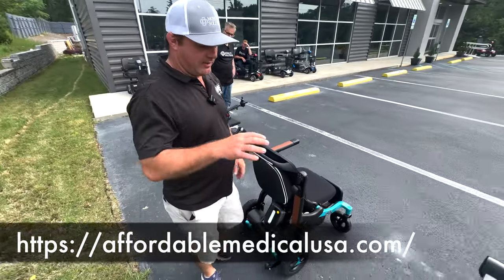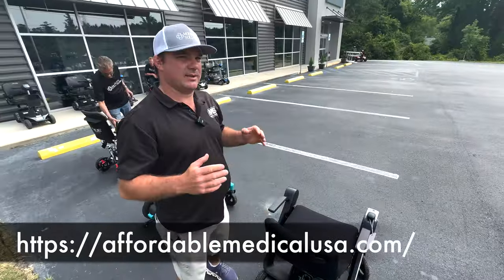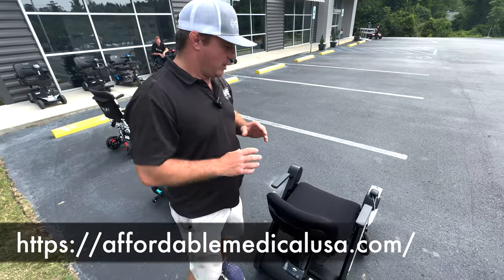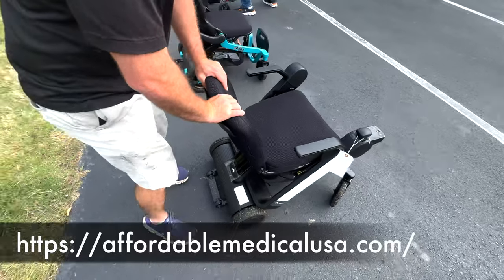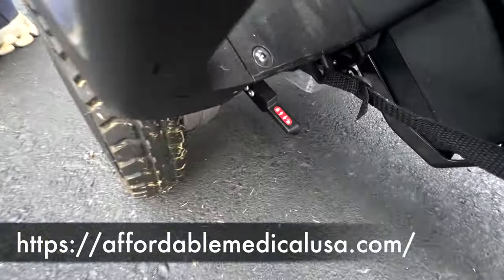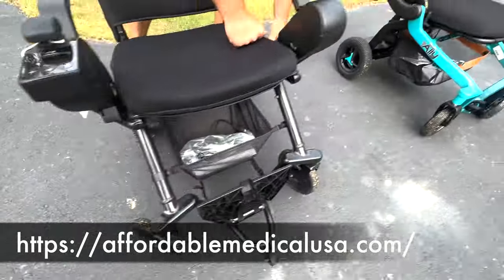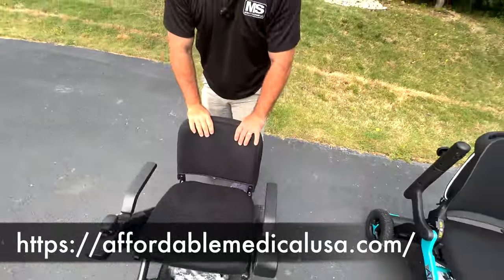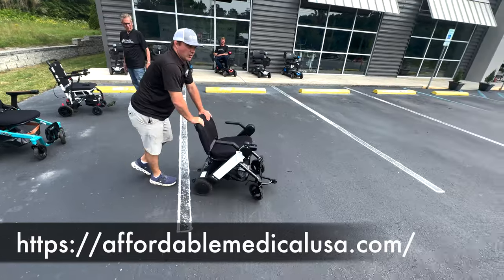Another cool thing about these chairs, all three of them, is that if you get somewhere and it's tight spaces and someone gets nervous, you can roll these like a transport chair. Now this one's going to be a little bit harder because you got your hands down here and you have to release the motors from here. Release down, the other side down. Now from here, if someone's in it, you can push them like this. I'm about 5'7", so I'd be bending over.